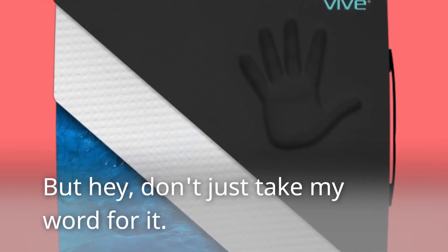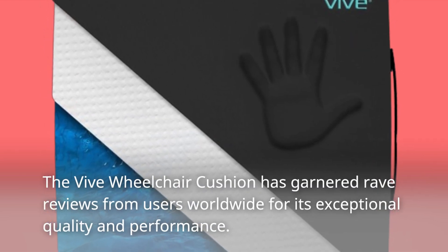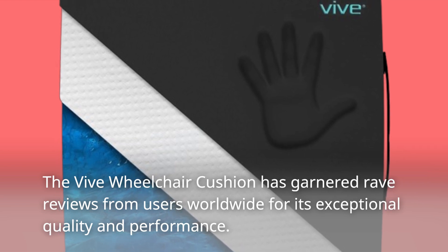But hey, don't just take my word for it. The Vive Wheelchair Cushion has garnered rave reviews from users worldwide for its exceptional quality and performance.